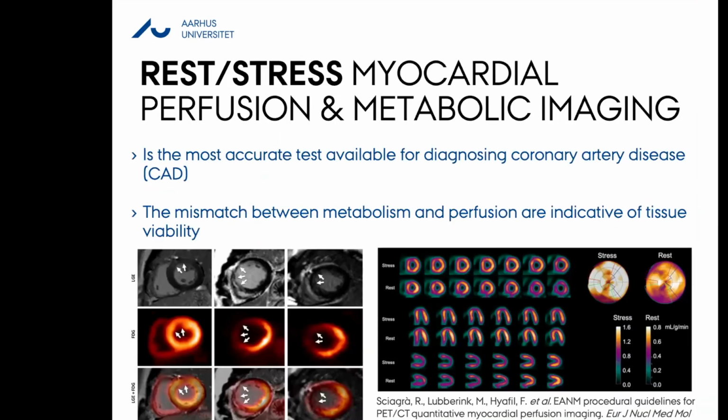So another way of improving the cardiac exams in the metabolic imaging space is to use rest stress myocardial perfusion, and also for metabolic imaging, at least that would be for our case. But you can see that you have this viability PET where you use the FDG signal and you have your perfusion signal, and you can use that information to say something about what tissue is viable and which tissues are not viable, and also to look at other indications for cardiac diseases.